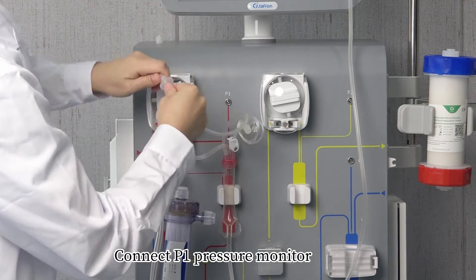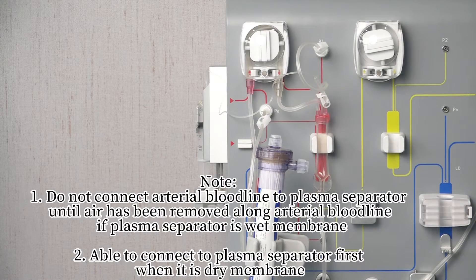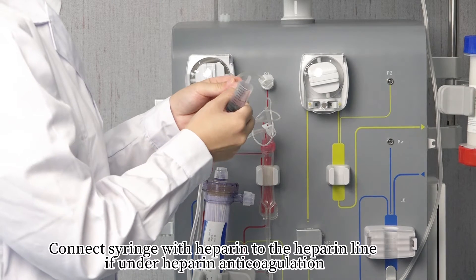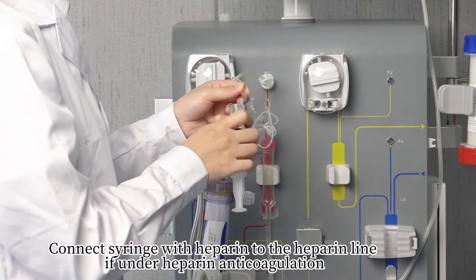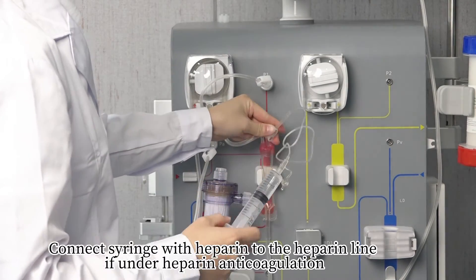Connect the P1 pressure monitor. Note: Do not connect the arterial bloodline to the plasma separator until air has been removed along the arterial bloodline, if the plasma separator has a wet membrane. You are able to connect to the plasma separator first when it is a dry membrane.